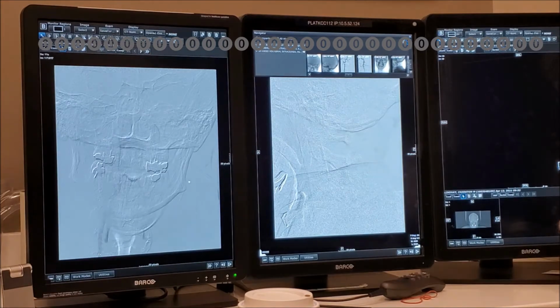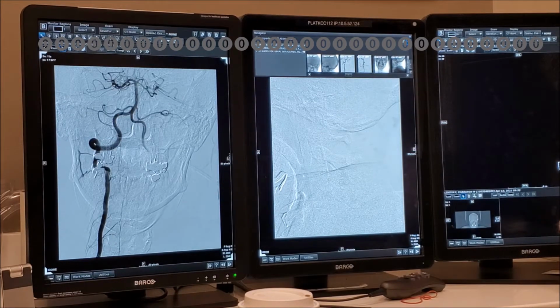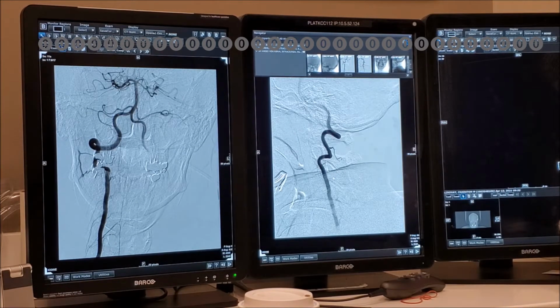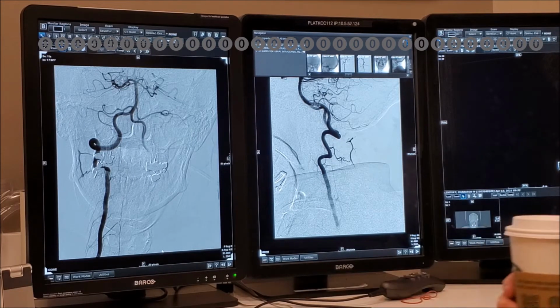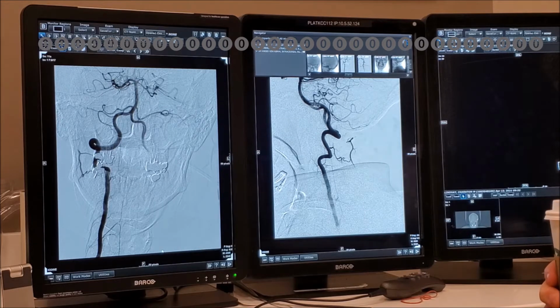Okay, so you were looking for, wow, oh, nice. Why did I get all happy here? Now you can see, what is this thing? A spinal artery. What spinal artery? The cervical. Which one? No, but is it anterior, posterior, lateral, or what? Anterior. And how do you define that? It should be running directly along the midline.